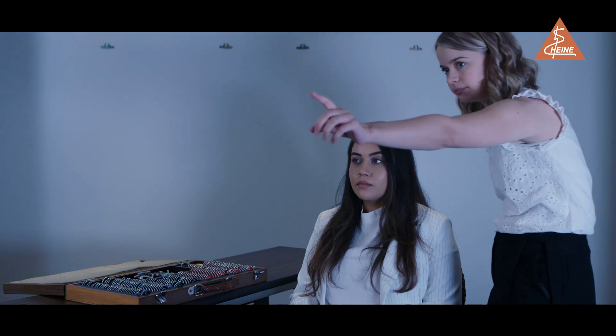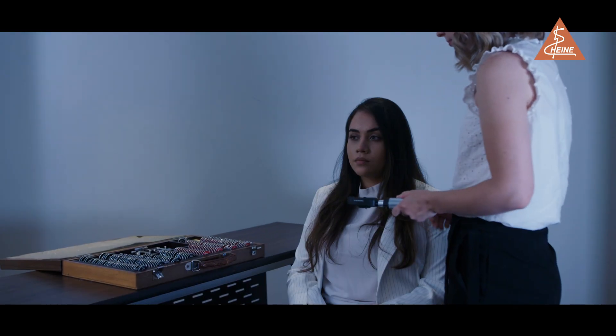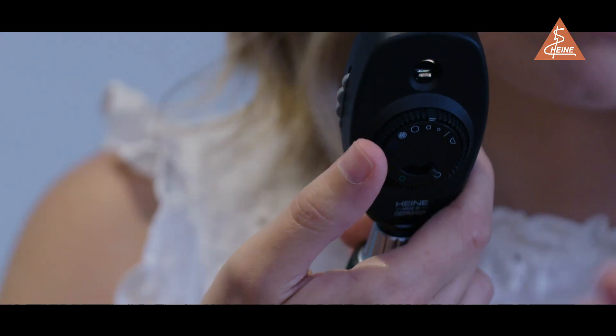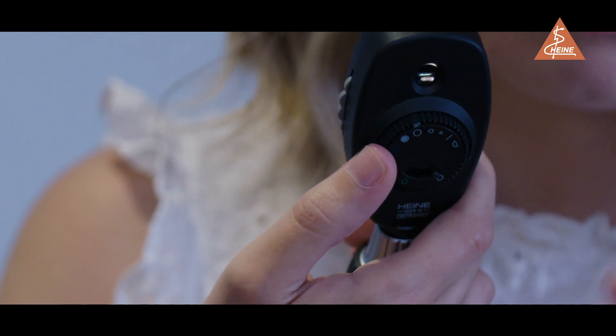Direct Ophthalmoscopy provides a magnified true image of the patient's posterior segment. Place the patient in a dark room to maximise pupil size and ask them to fixate on a distance target. Set the ophthalmoscope to the medium aperture if undilated, or the maximum if the patient is dilated.